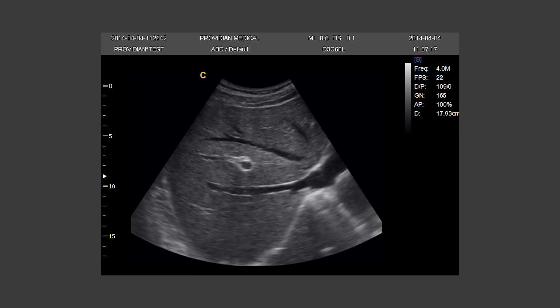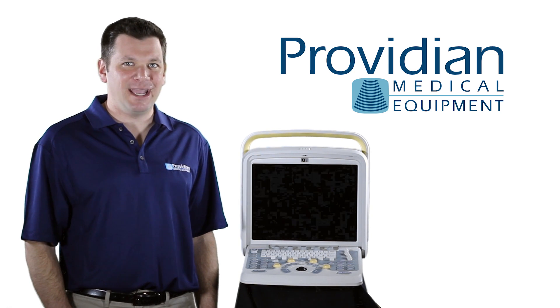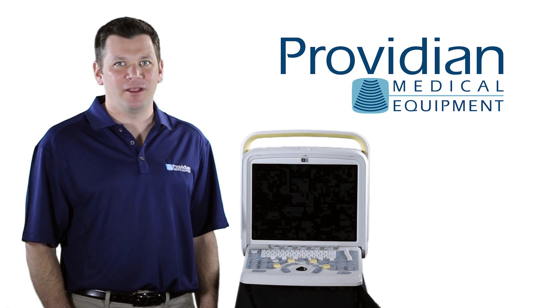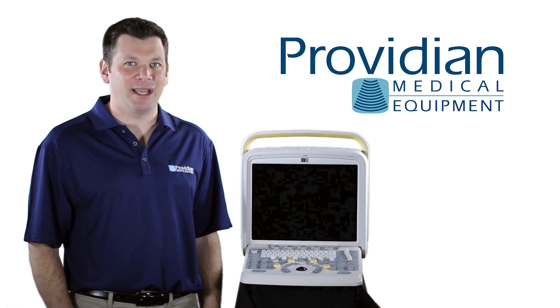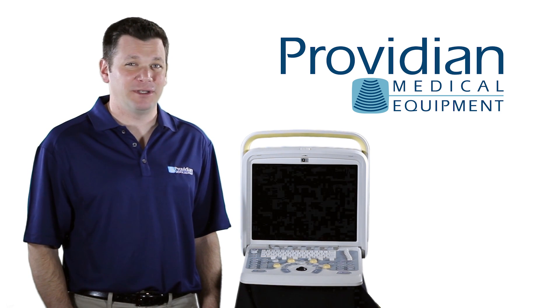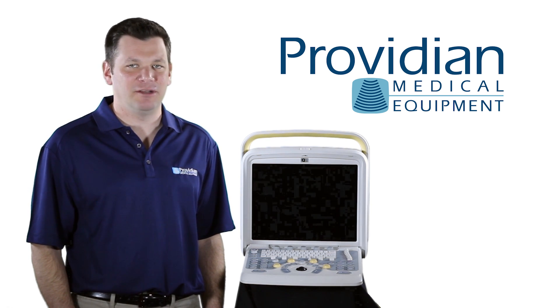The best part about the Chison Q5 is its versatility and it fills a void often left by other machines in its class. But for whatever it gains there, it lacks in some image quality. It has an acceptable image quality and it's typical for machines in this price range. There are other machines with better image quality, but what those machines lack is the versatility, ease of use, and more complete measurement and analysis tools. Talk to one of our sales experts about the pros and cons of each system and we'll help you find the best machine for your needs.